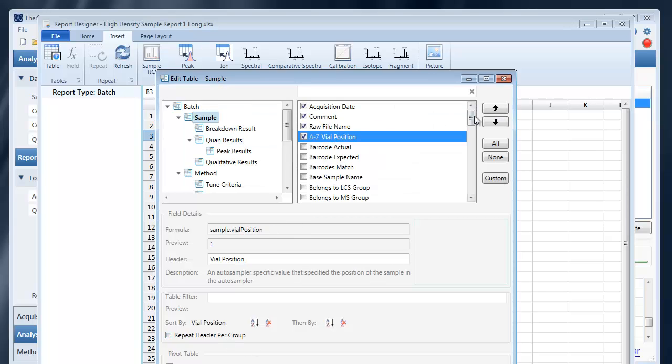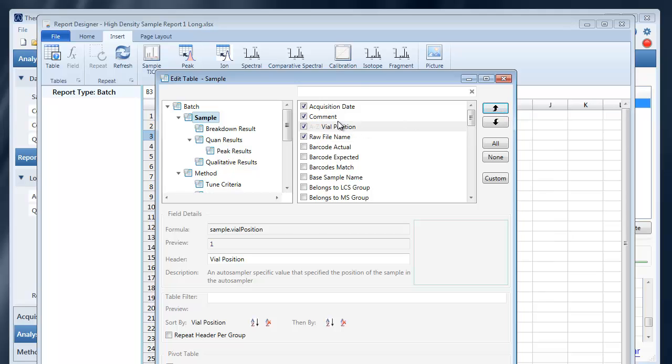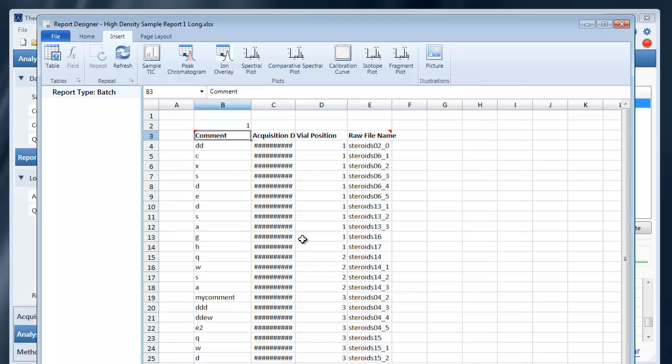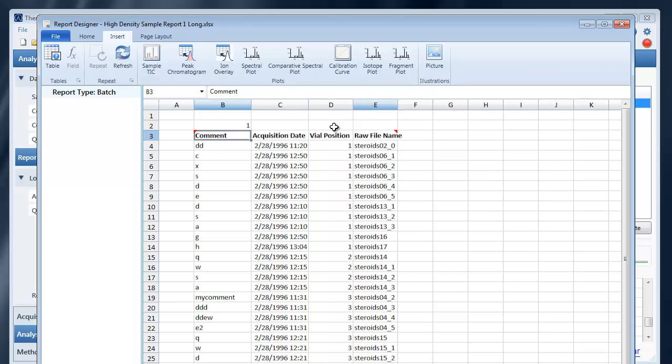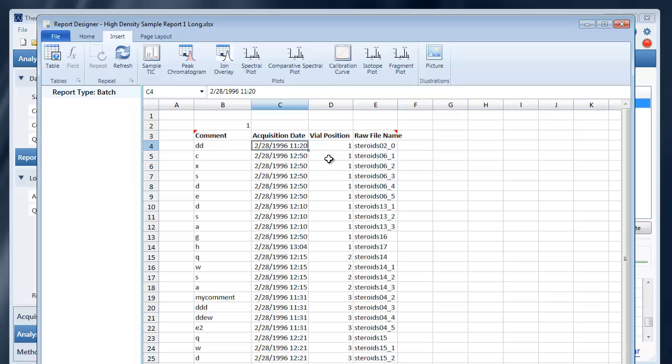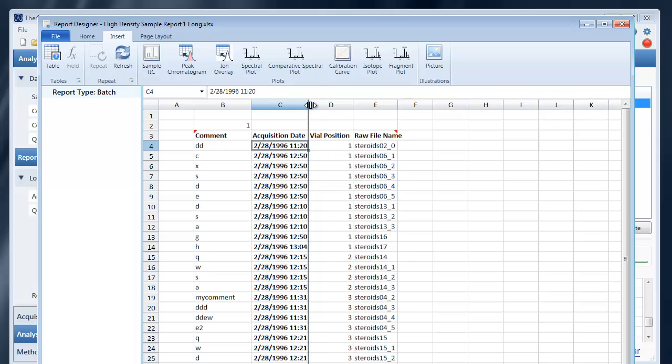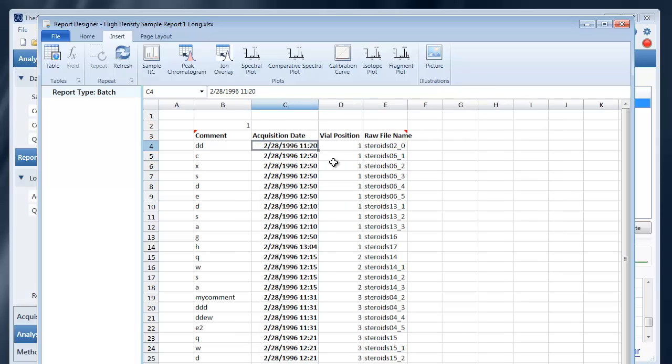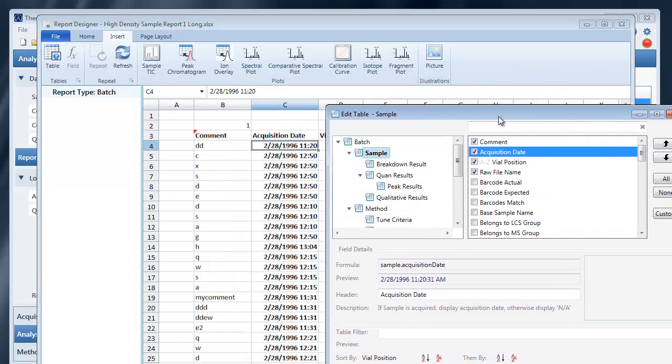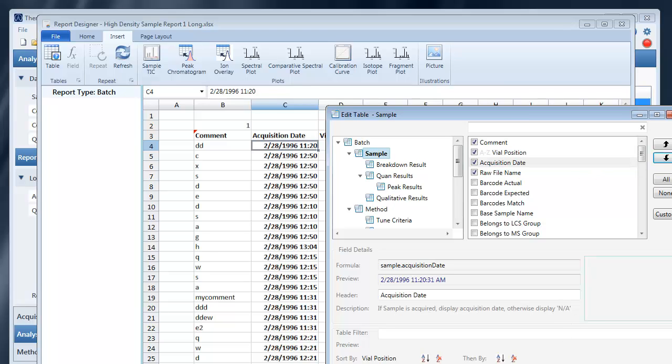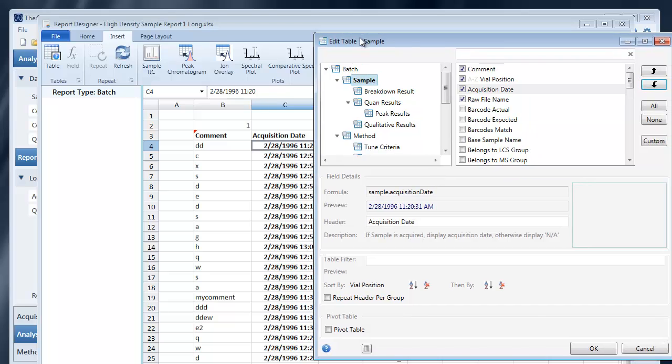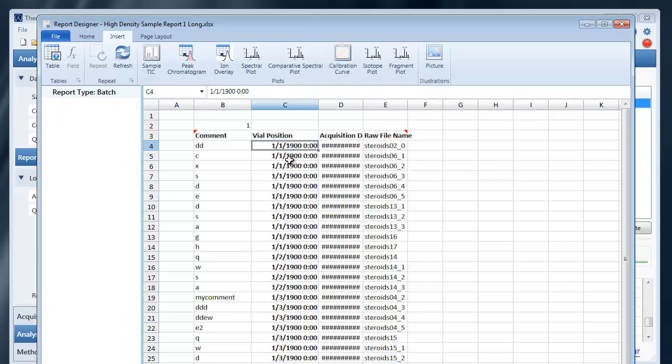You can also move, change the order of your columns. Now you'll notice in this version of 3.2 that if you switch the order of your columns the formatting doesn't necessarily shift with it. The formatting stayed with this column.